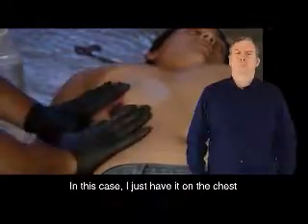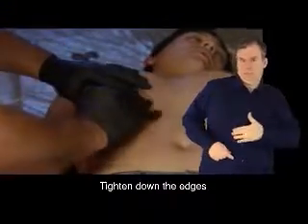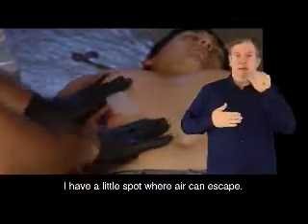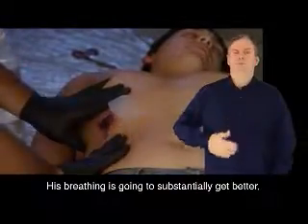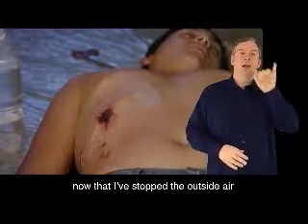In this case, I just have it on the chest, so I go ahead and put the Halo chest seal in place, tighten down the edges, and right where the flap is, I have a little spot that air can escape. His breathing is going to substantially get better now that I've stopped the outside air from coming into the chest cavity.